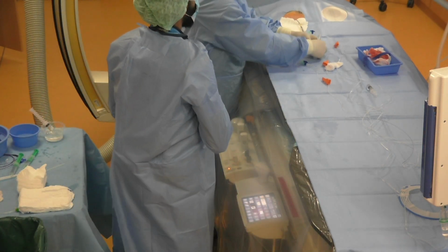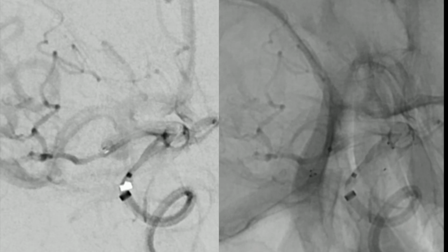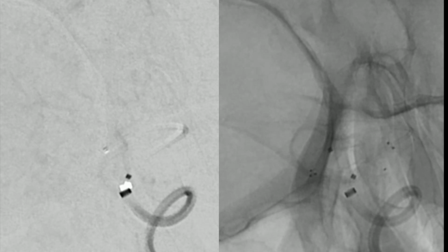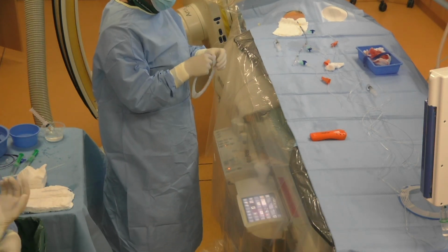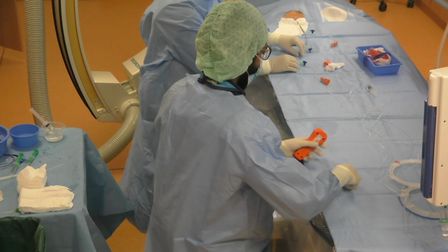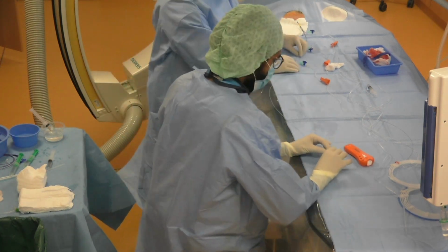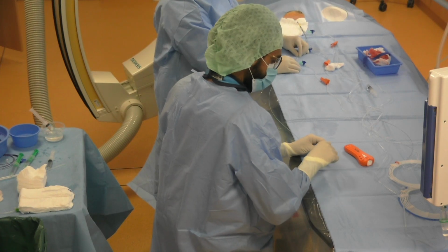We always perform a standard short angiogram to see that there's no extravasation or other complications. And as you can see, everything is all right. And now we take our first coil. It's from Target, 360, 5 millimeters by 30 centimeters, and push it in the microcatheter.